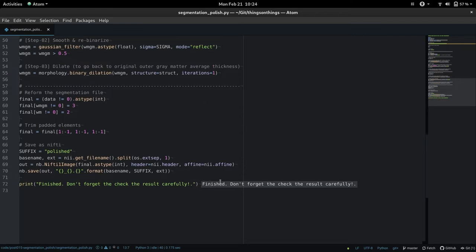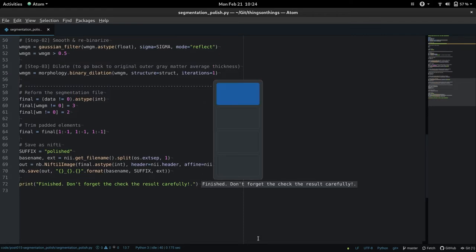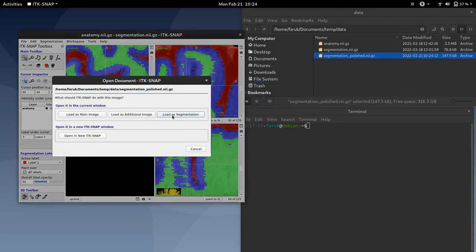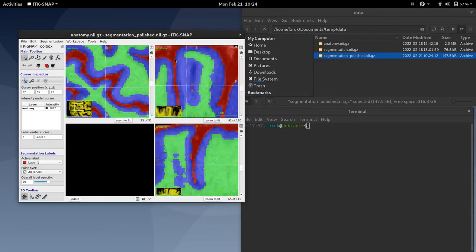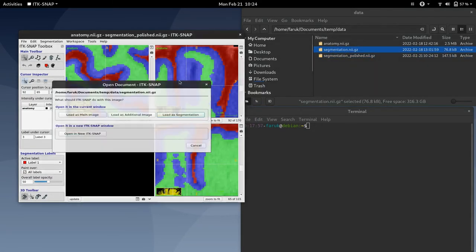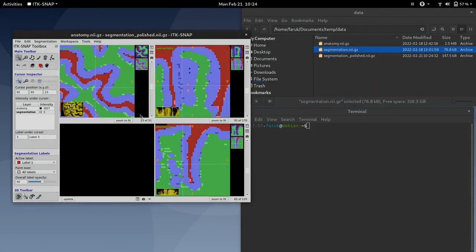Okay, finished. Don't forget to check the results carefully always. So here I am loading this file. Maybe I can load it as an additional image here.